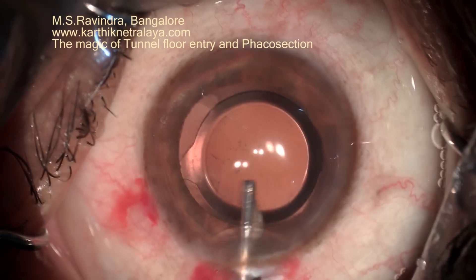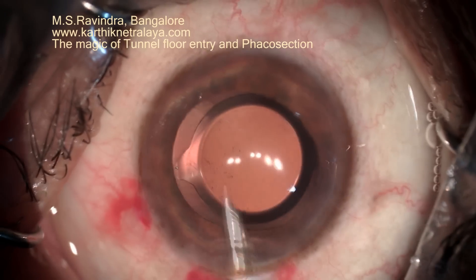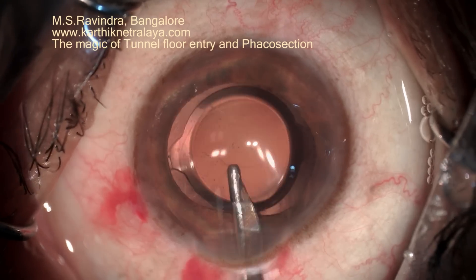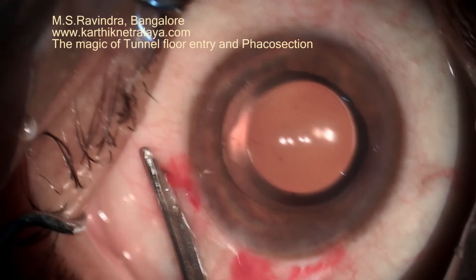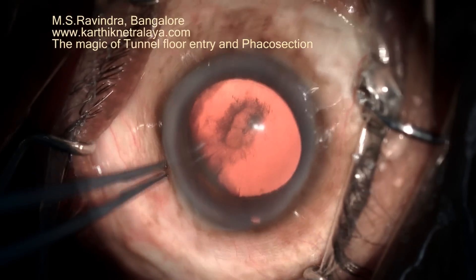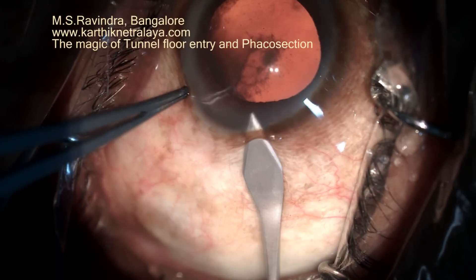There is no need for hydration as the tunnel is not stretched. There is no need to form the chamber at the end. There is no need for bandaging the eye, and the patient will have immediate rehabilitation. The entire surgery is done under topical anesthesia, so the patient can be well rehabilitated.